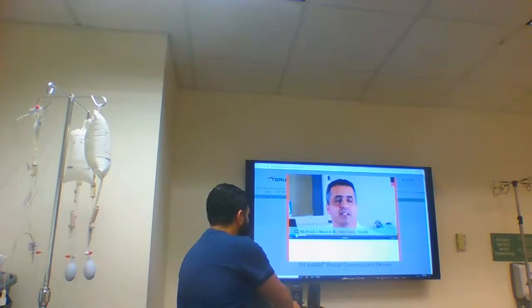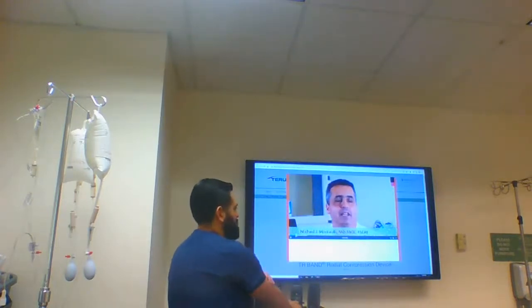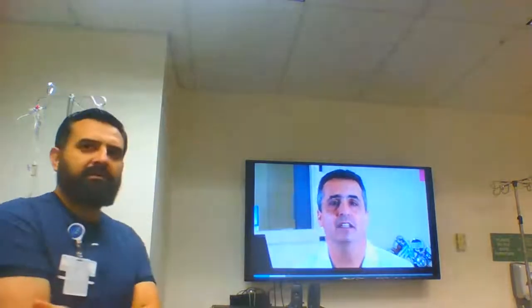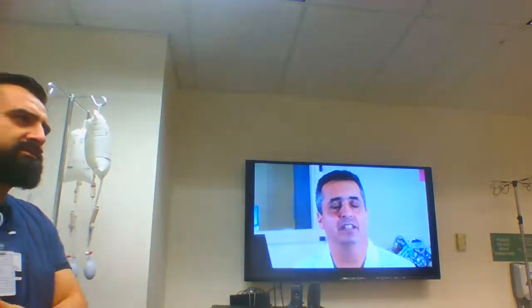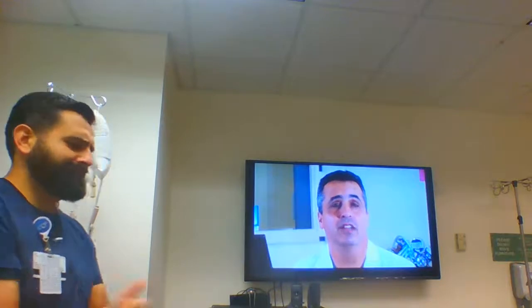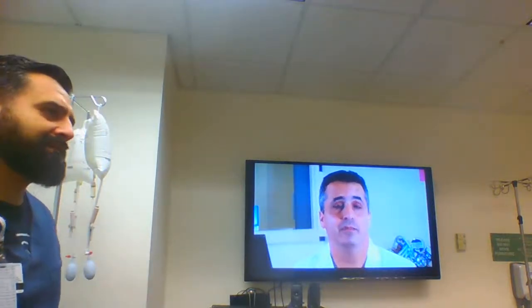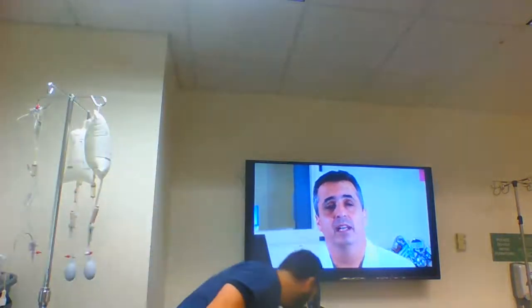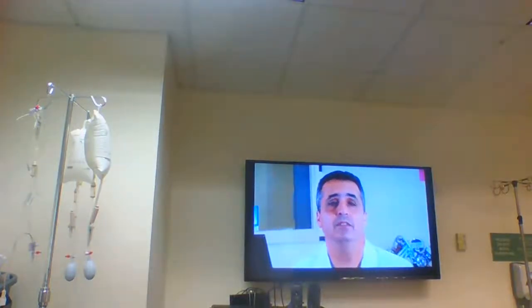Hospital in Albany, New York. Today, we're going to be discussing the application and removal of the TR band. The TR band is used to apply low pressure hemostasis at the site of radial artery access and sheath. We'll discuss the importance of the TR band, and the reason why low pressure hemostasis is to attempt to reduce the incidence of radial artery occlusion following radial artery catheterization.